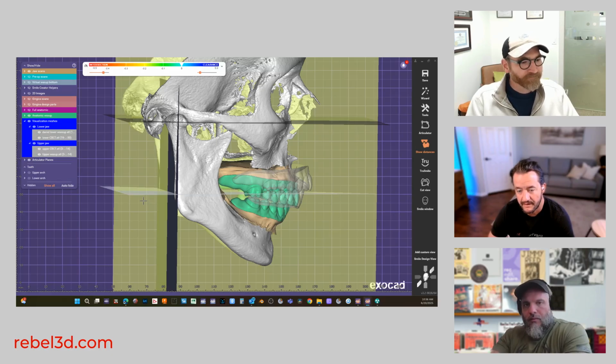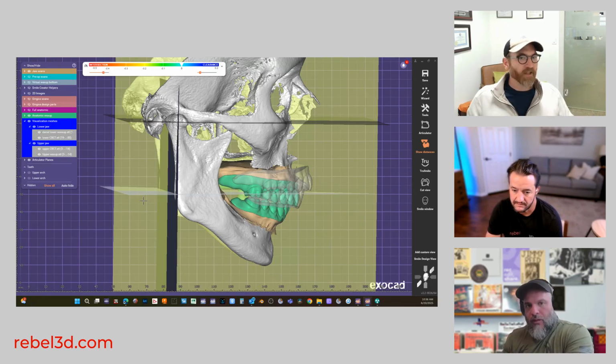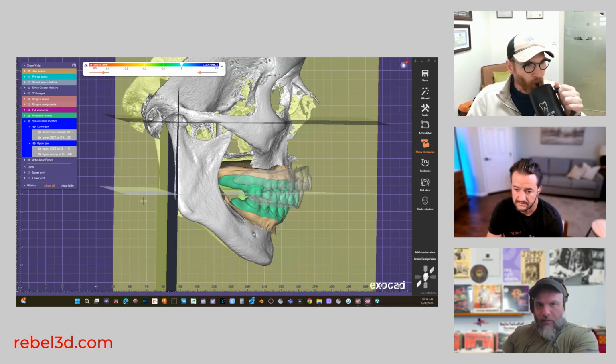As a designer, the problem that I'm going to see from this is how many iterations of the case we're going to have to do. Yes. So put aside what can happen to the patient anatomically. It's just the fact that now your patient is mad because now he has to come back and see you multiple times. Right.